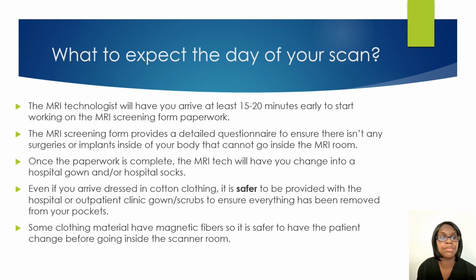Whenever they do, they want to be detailed whenever they are filling out the MRI questionnaire so that they can put any surgeries, implants, so that we can know if it's safe or not safe for them to go inside of the room. After the patient does complete the paperwork, the MRI tech should go back over it with them. They should go back through each question just to make sure the patient understood it and the patient answered it correctly.